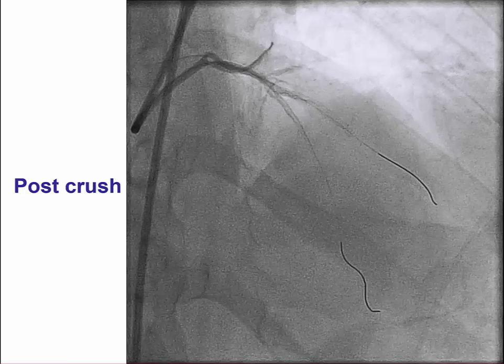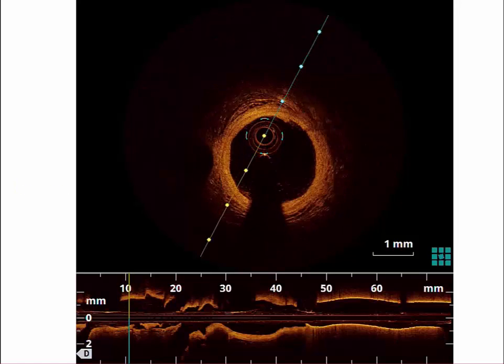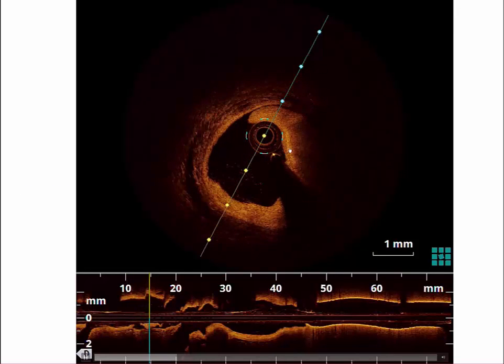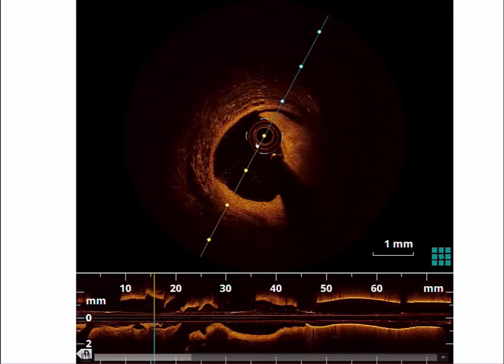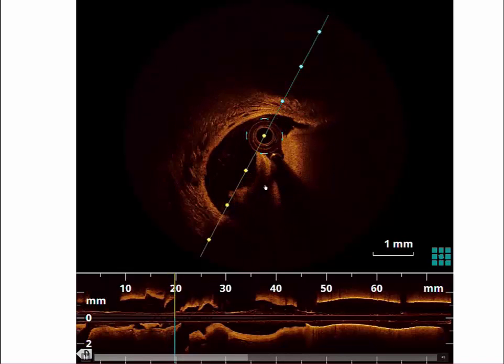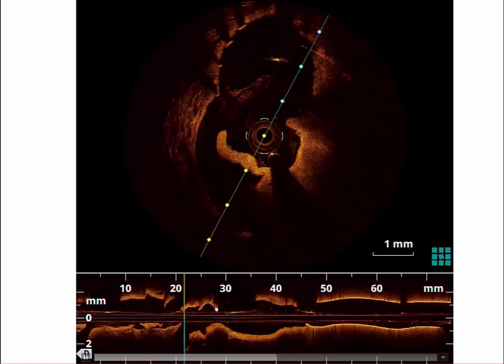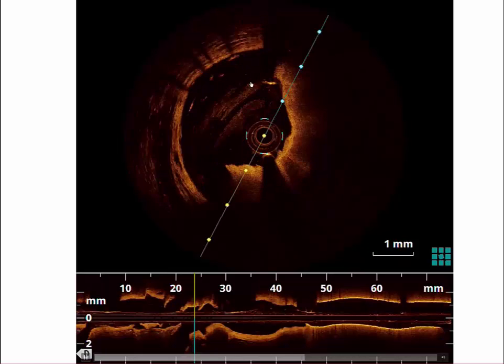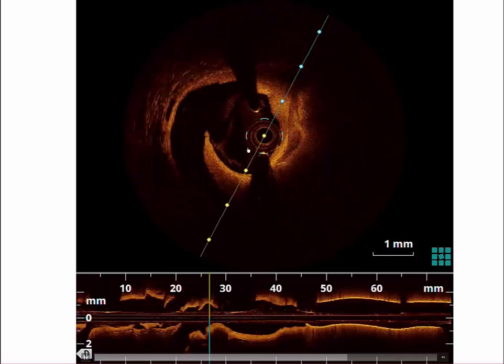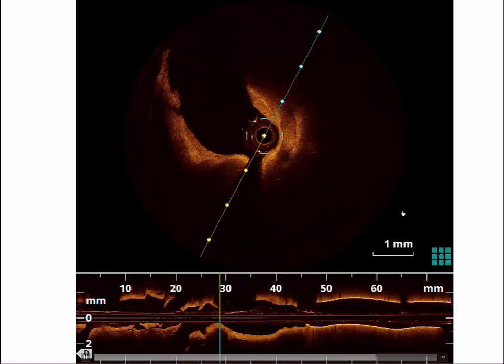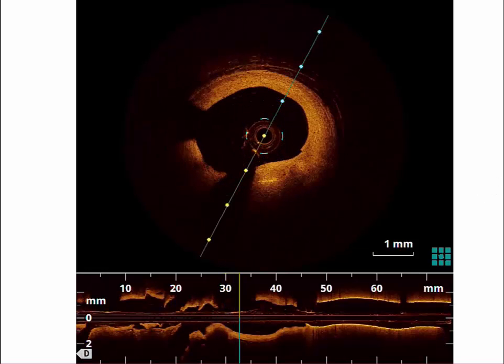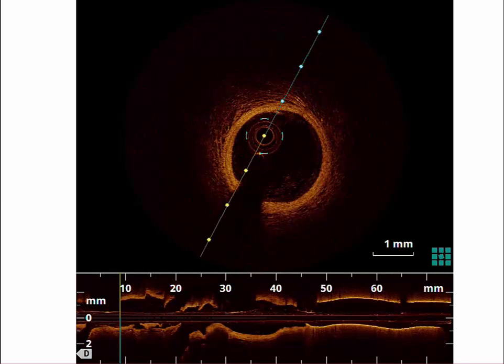This is optical coherence tomography, which is interesting, illustrating the dissection in the main vessel as well as some thrombus formation there. As we move close to the side branch, we see a good result with good maintenance of ostial patency. The proximal vessel is mildly diseased.